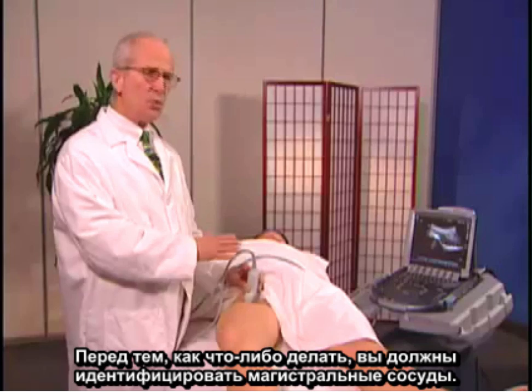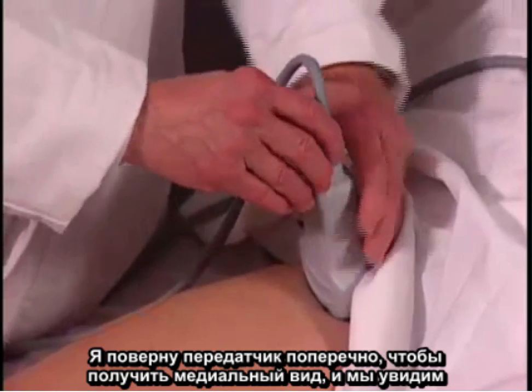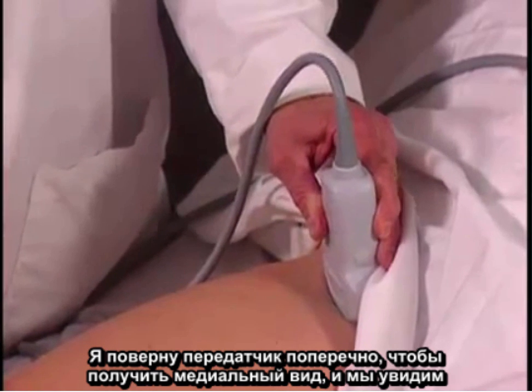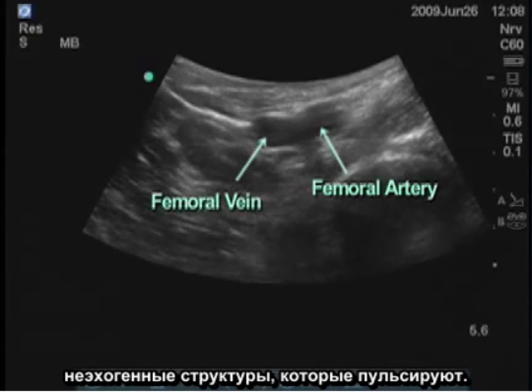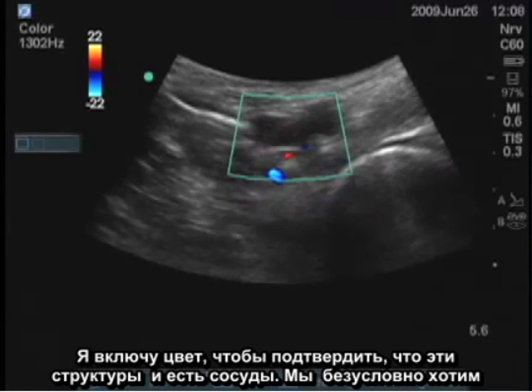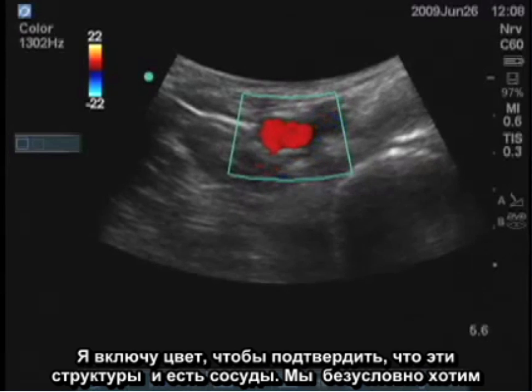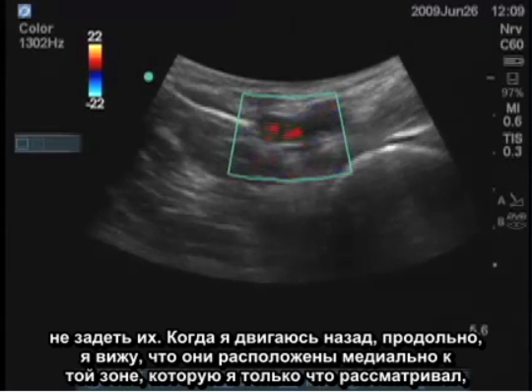Before you do anything, you want to identify the great vessels, and I will turn the transducer transversely and look medially, and we can see the anechoic structures that are pulsating. And I'll turn on the color. We should be able to confirm that those are the vessels, and we want to obviously avoid those.